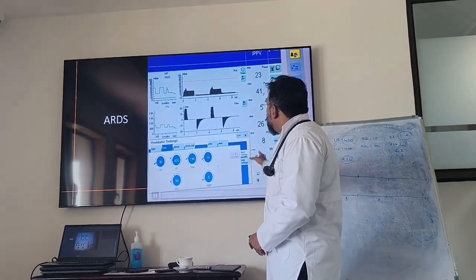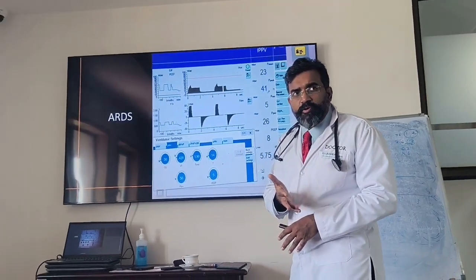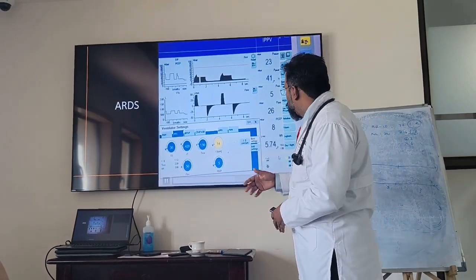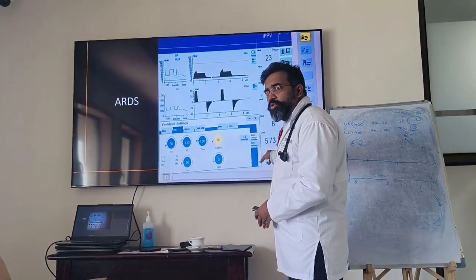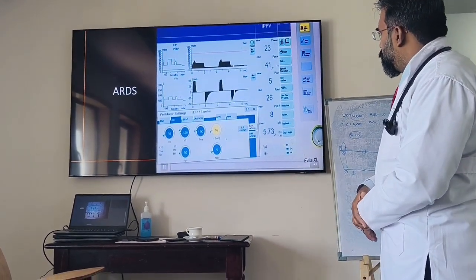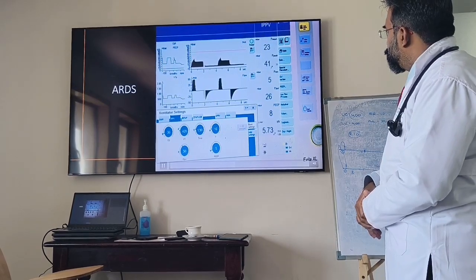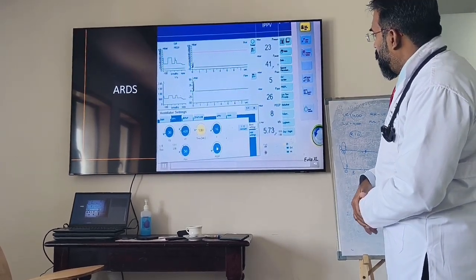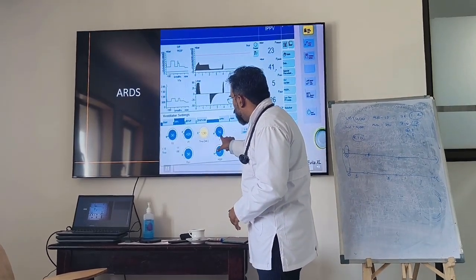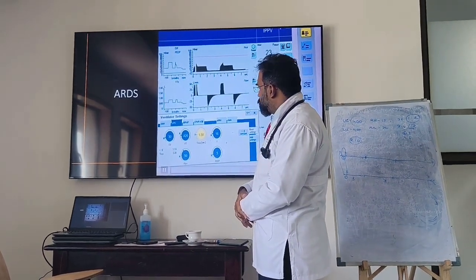So these are the variables that you have to have on your ventilator to understand what is happening. If you don't have these on your ventilator, how do you understand what is happening? Are you understanding? So I have to increase my RR, as it has gone low. So I have increased my RR to 16, okay? And let's see what happens at 16. I:E ratio was held constant, okay? So what is changing? I have to change my I:E ratio because it became 1:1. See? When I changed my RR to 16, it became 1:1.